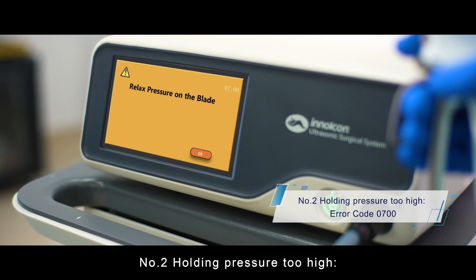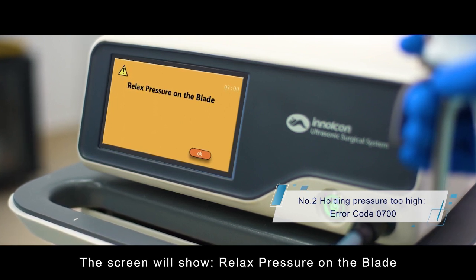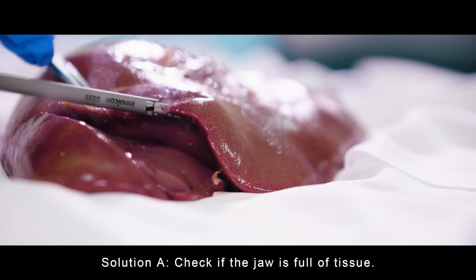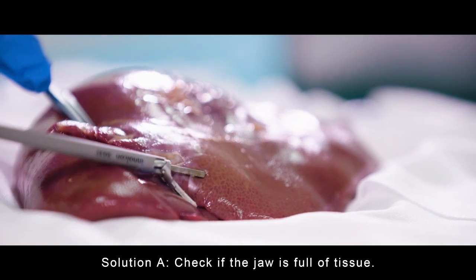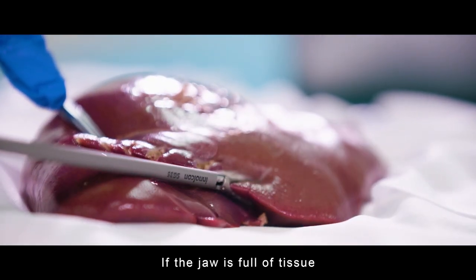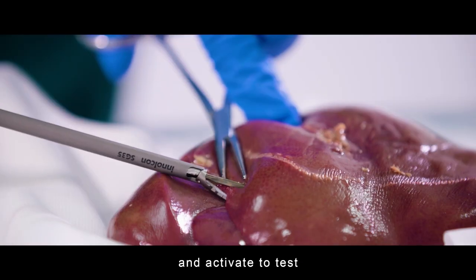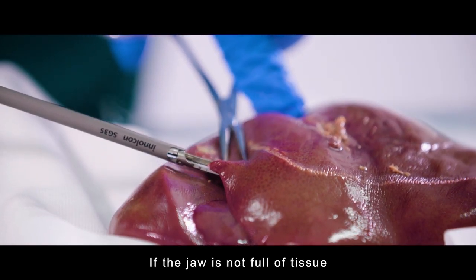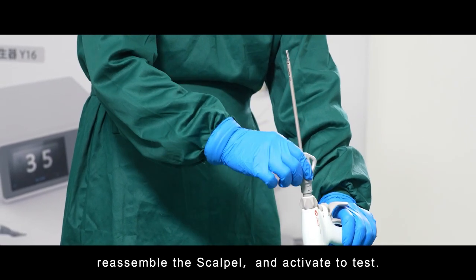Number 2. Holding pressure too high. The screen will show: Relax pressure on the blade. Solution A. Check if the jaw is full of tissue. If the jaw is full of tissue, remove the tissue amount underneath the jaw and activate to test. If the jaw is not full of tissue, reassemble the scalpel and activate to test.